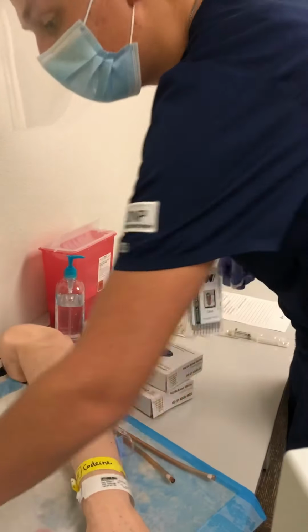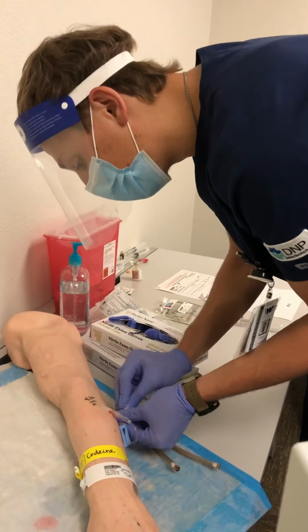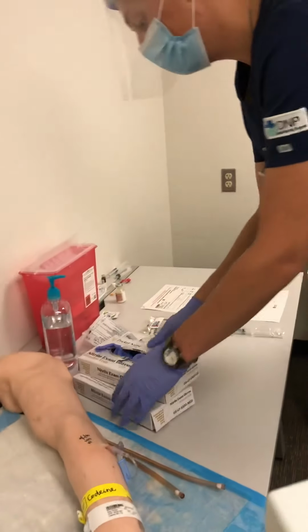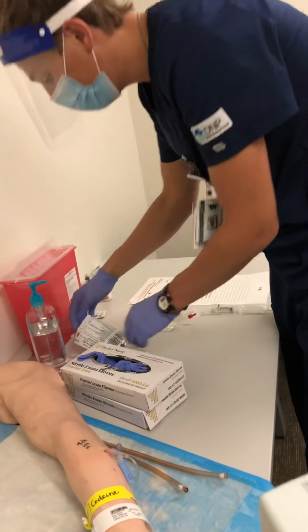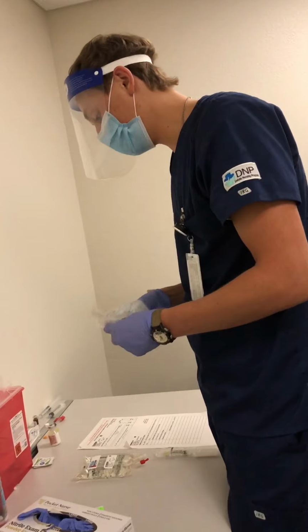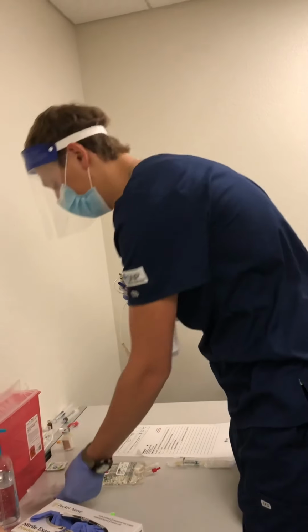So this will be garbage, and now since I've done that, I can clean here. Okay, so now I can get ready to hang my bags here. I've already done my medication checks, and this primary tubing is new and everything. There's no holes in it or anything. And it's not expired, so I can pull it out.